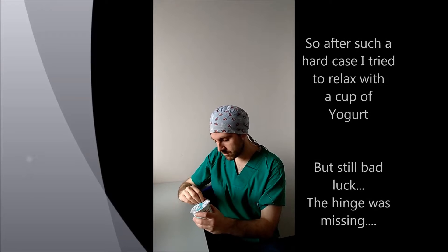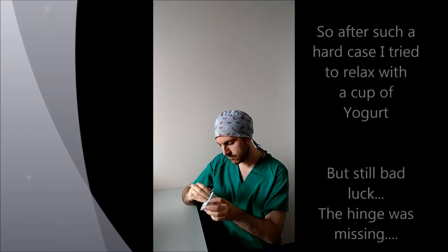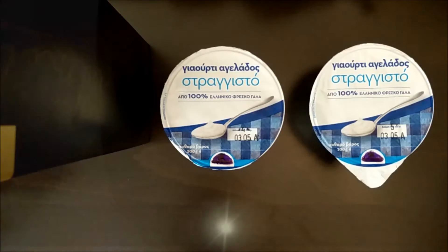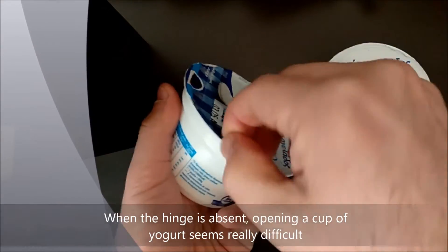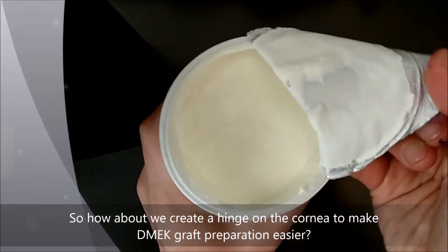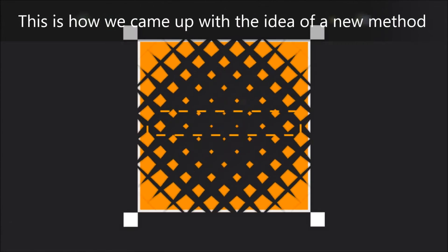After such a hard case, I tried to relax with a cup of yogurt — but still bad luck: the hinge was missing. You see, when the hinge is absent, opening a cup of yogurt seems really difficult, maybe impossible. So how about we create a hinge on the cornea to make DMEK graft preparation easier, like opening a cup of yogurt? And this is how we came up with the idea of a new method: the Yogurt Technique.